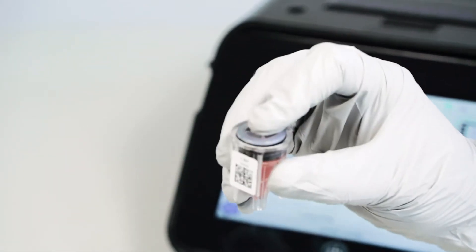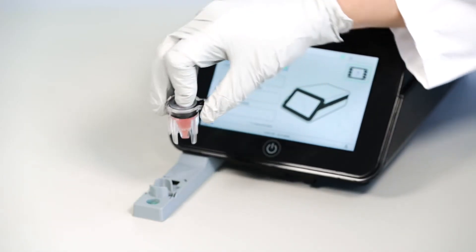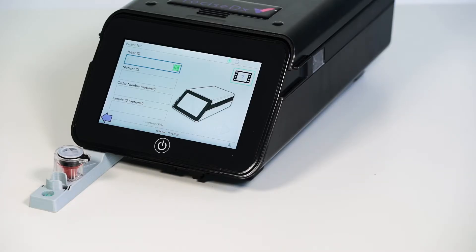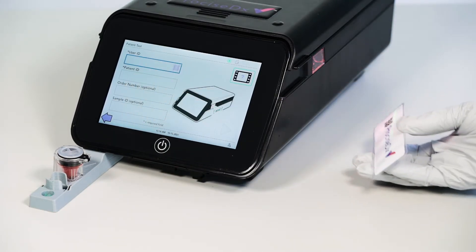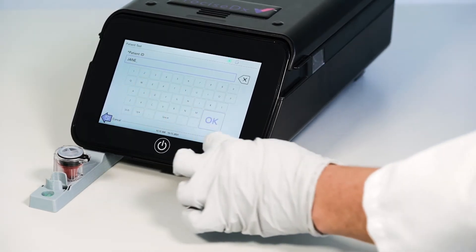Invert quickly and vigorously five times to activate the cartridge. Now, set up the test on the Precise DX system. Enter required fields such as user ID and patient ID. You can scan a barcode by pressing the barcode icon or type the information by selecting the field.